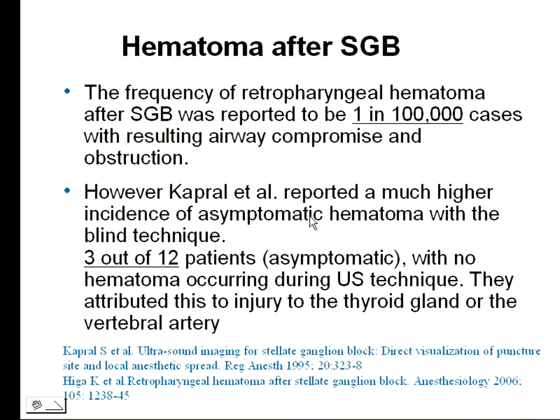And it's very difficult to design a study to prove that ultrasound is safer. You're looking for a complication or a fatality of 1 in 100,000. So you want to recruit 2 million in each arm to come up with an RCT showing safety. That's why we use surrogates. Yes, I can avoid the carotid artery, vertebral artery, the esophagus, and this, again, is common sense.